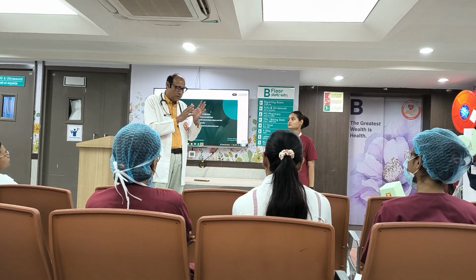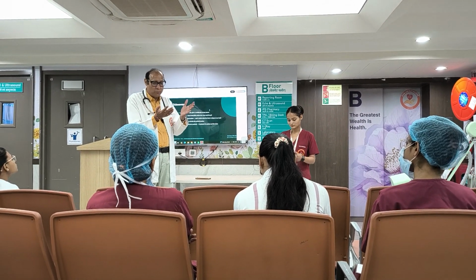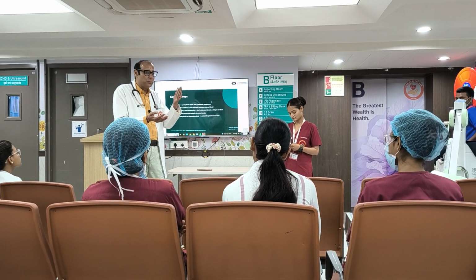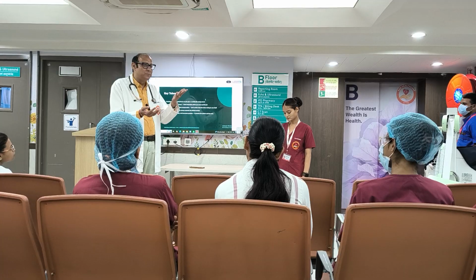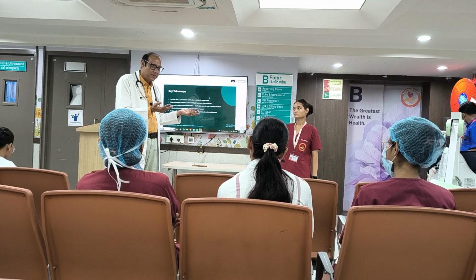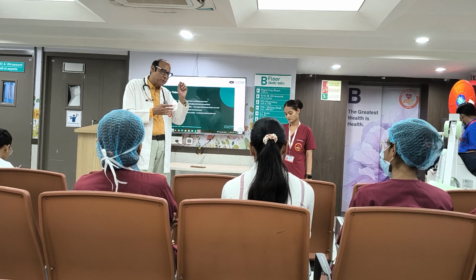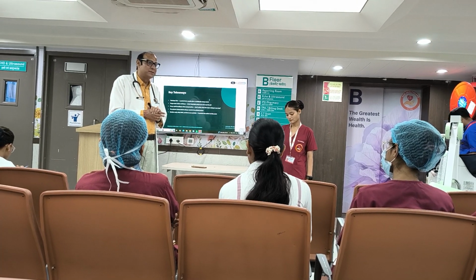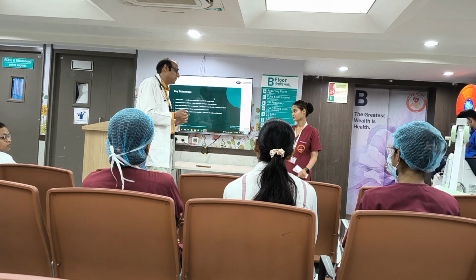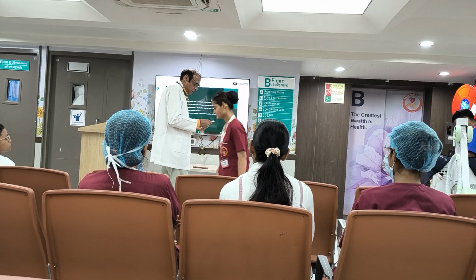If you don't know what kind of sample you have, look at the SpO2. If SpO2 is less than like 70 or 75, the sample could be contaminated, maybe venous. So SpO2 will always tell you exactly whether it is arterial or venous. It tells you whether the sample is oxygenated or venous. Okay, thank you.